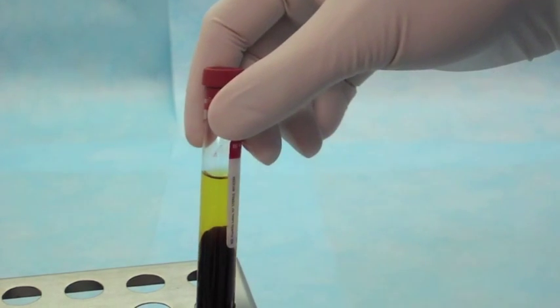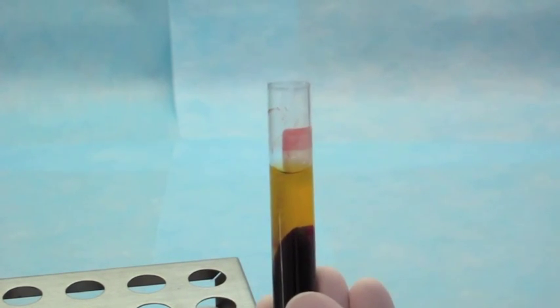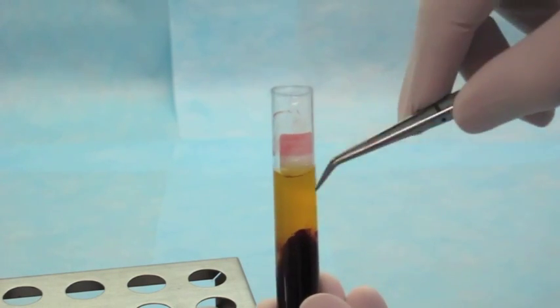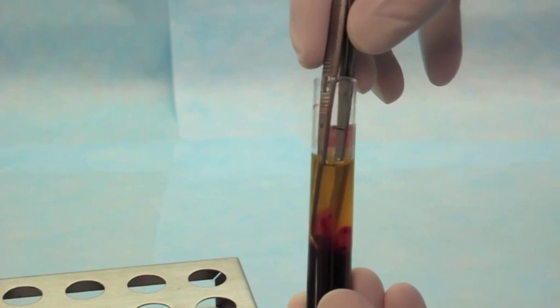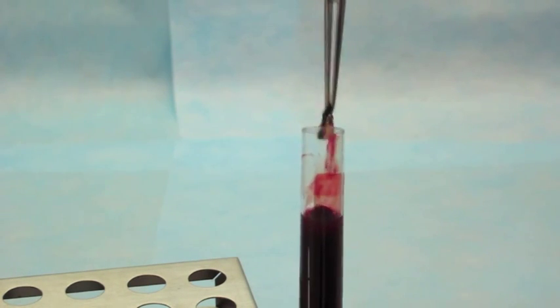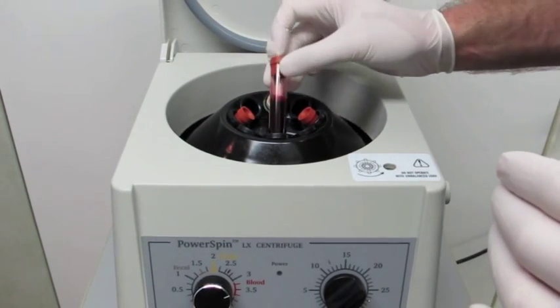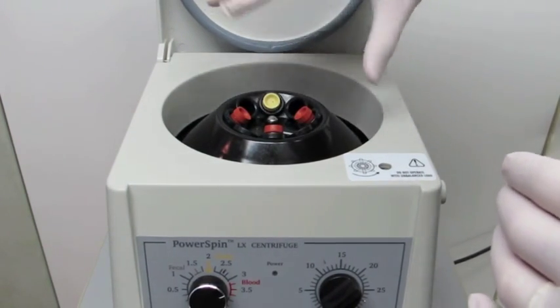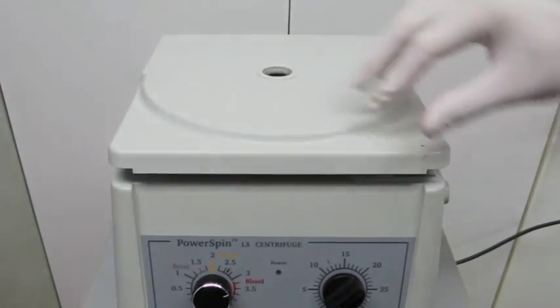It's necessary to get the tubes to the centrifuge before the red blood cells coagulate, as the red top does not have an anticoagulant. If you spin it down too late, you'll get some plasma but no clot — the clot will have formed in the red blood cells, trapping all the growth factors there, which renders it useless. Also, when placing tubes into the centrifuge, be careful not to put your finger over the top of the tube, as you'll invariably get blood on your finger and then on the centrifuge lid when you close it.